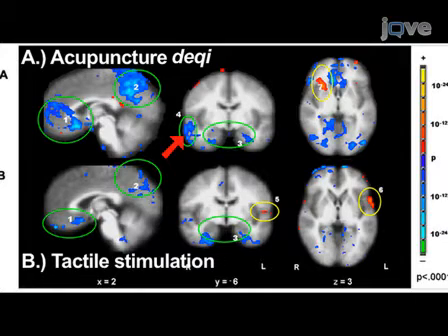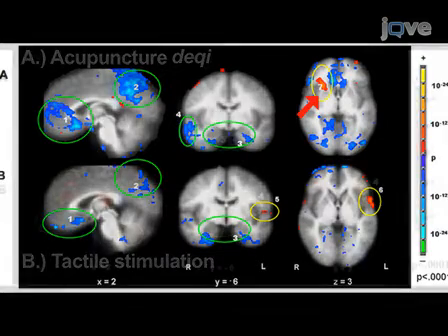The right lateral temporal lobe also exhibited more marked deactivation during acupuncture. In contrast to deactivation, tactile stimulation showed more activation of the sensory motor BA43 and association cortex BA22. The right anterior insula was paradoxically activated during acupuncture, but not tactile stimulation.